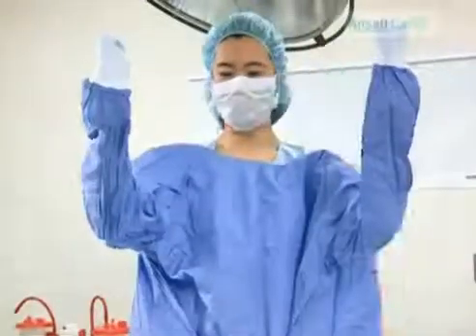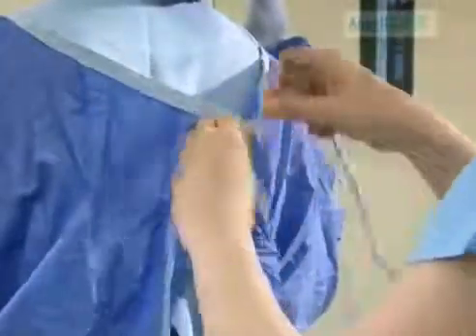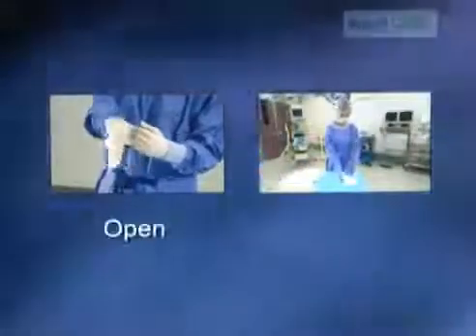The circulating nurse will tie your gown. It is important to remember your gown is sterile only from mid-chest to waist level. There are commonly two types of gloving procedures: open and closed gloving.